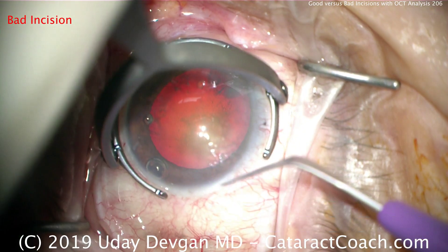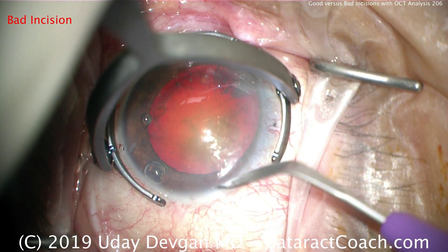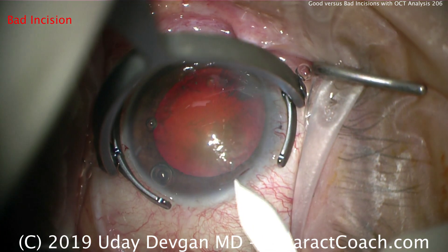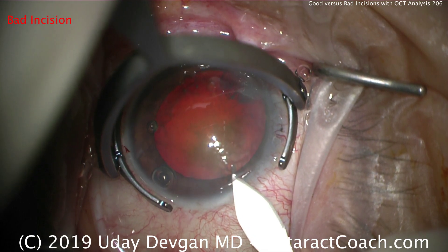Here's the same surgeon using the same technique but ending up with a bad incision — watch carefully. Making a little bit of a groove again to delineate the starting point. And here's the mistake: too shallow of an entrance point and a very thin roof.